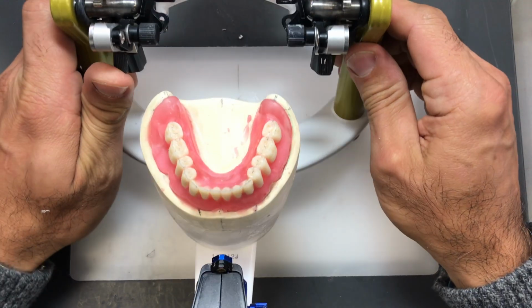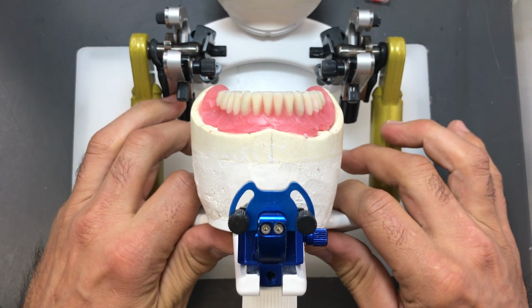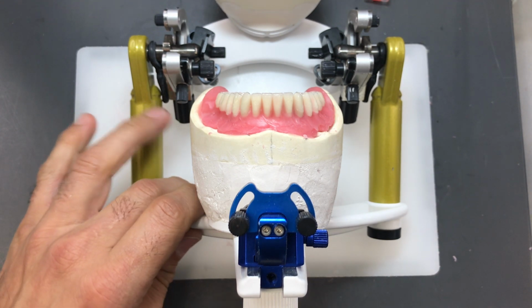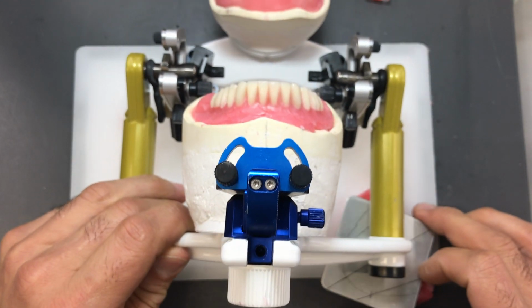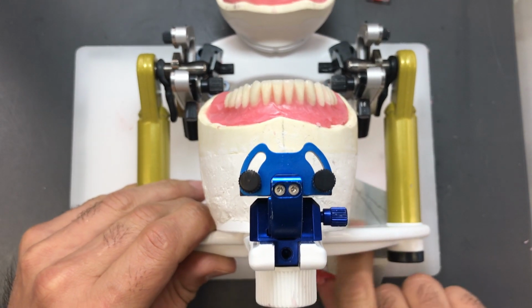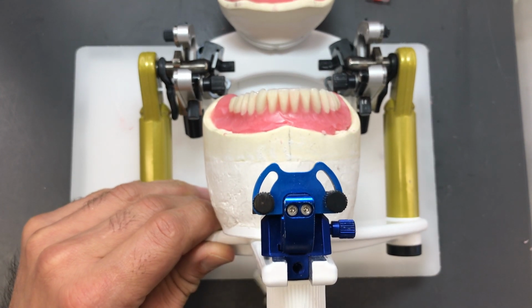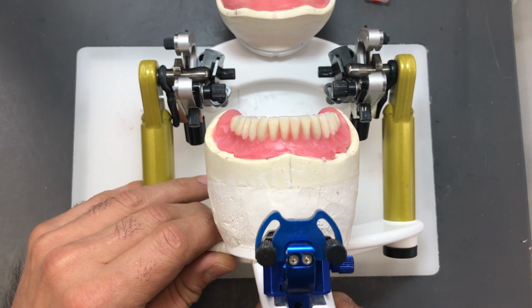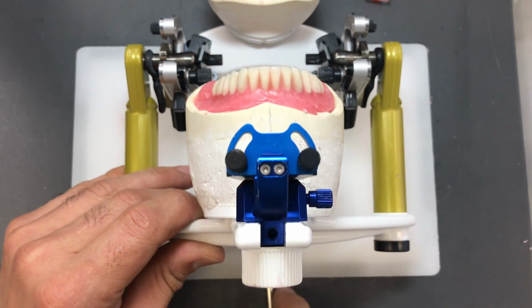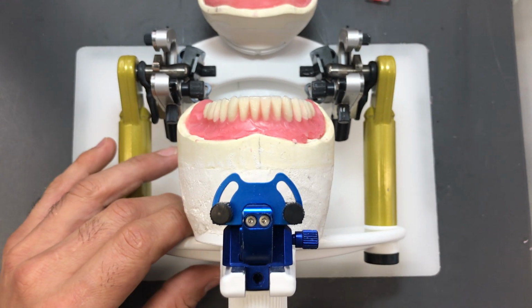When we look at it from a frontal view, just elevate this a little bit to get a better view. So it appears that the incisal edges are pretty much on the same level as the remaining posteriors.